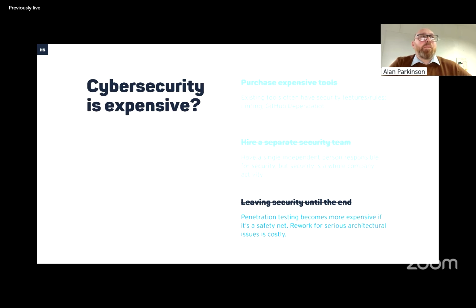The biggest mistake would be leaving security to the end. If you don't implement a lot of this in the secure development lifecycle, one, you're going to get asked for it later on, so you're going to have to go back and implement it. Two, a lot of security issues will get through to your penetration test, the independent report you need to have done.